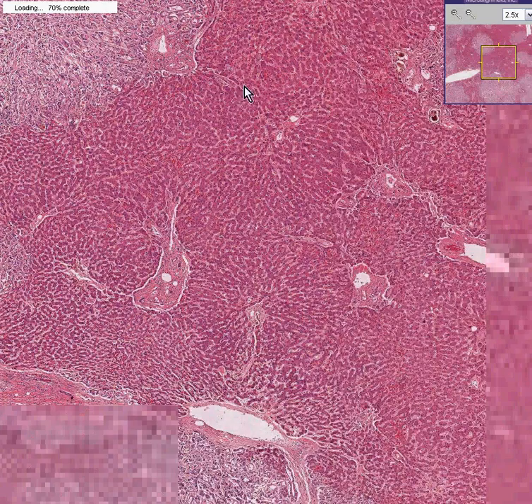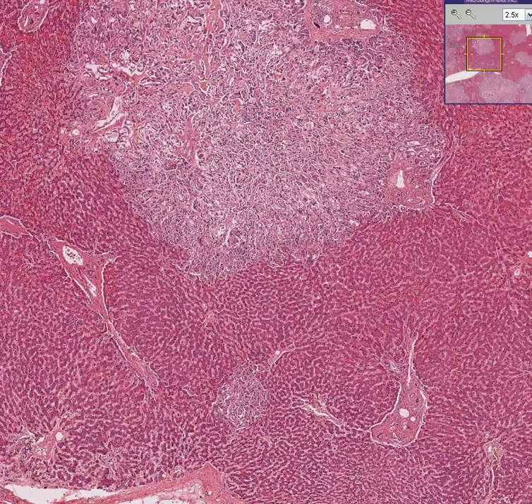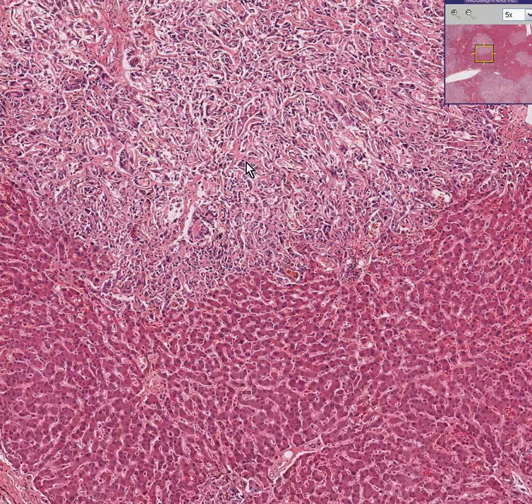Here's an area of normal liver in between the tumor. There are ways of telling whether these malignant glands, however, originated from bile duct epithelium, which would make it a primary tumor of liver glands or cholangiocarcinoma. As you know, in the normal liver, the only glandular structures are bile ducts. So if you have a primary malignant adenocarcinoma of the liver, it would have to come from the bile ducts because there are no other normal glandular structures.